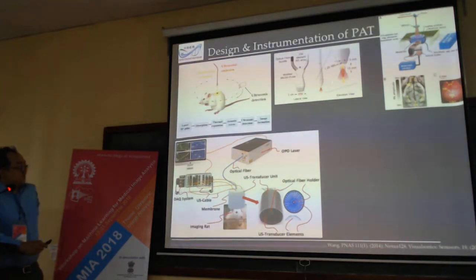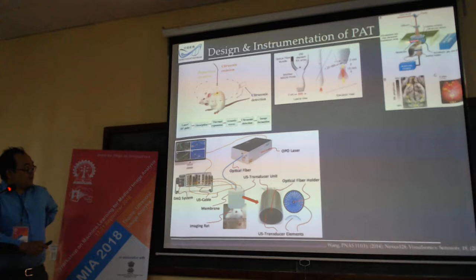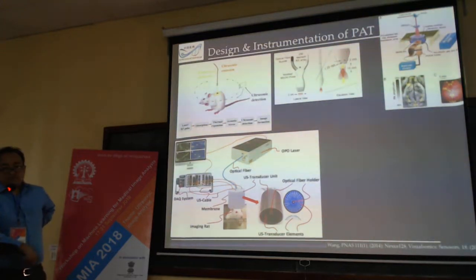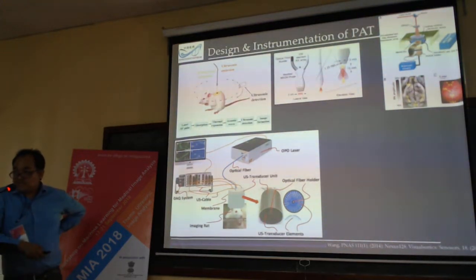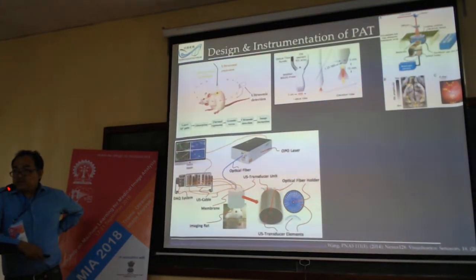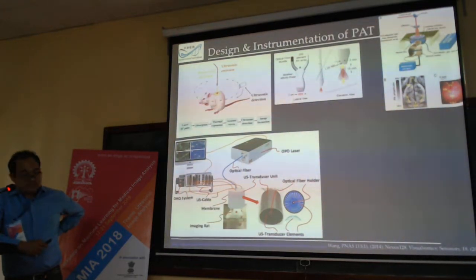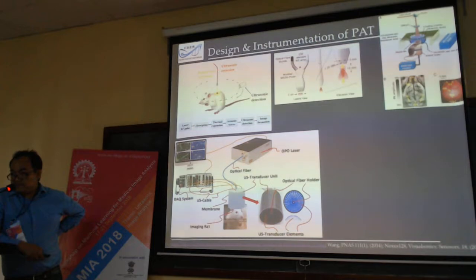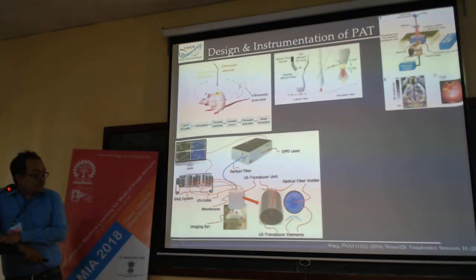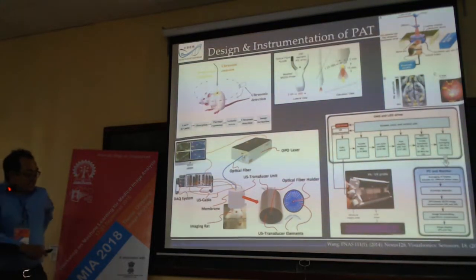With the existing ultrasound probe that is there in clinical ultrasound imaging, adopted with light illumination, light is delivered and ultrasound is detected by the same probe. For this kind of thing, we don't need the solution of the differential equation, so it can give real-time images. It has proven very successful for the reconstruction of the images.